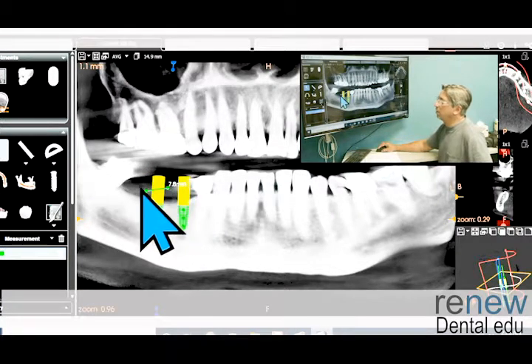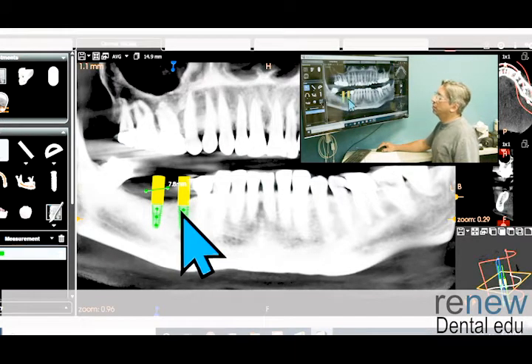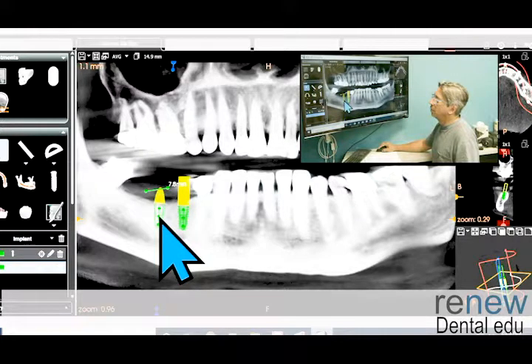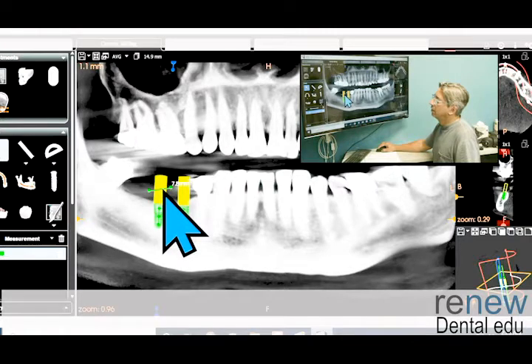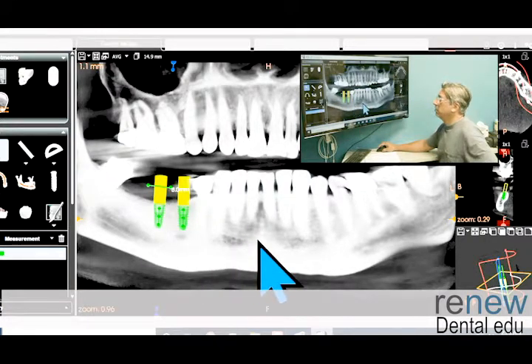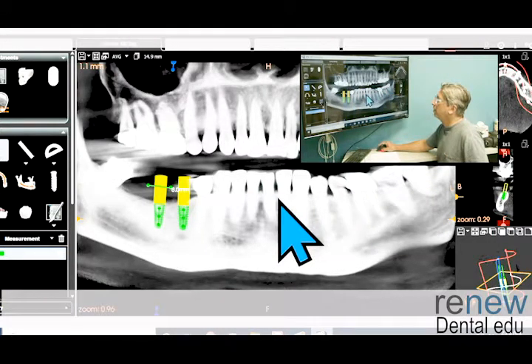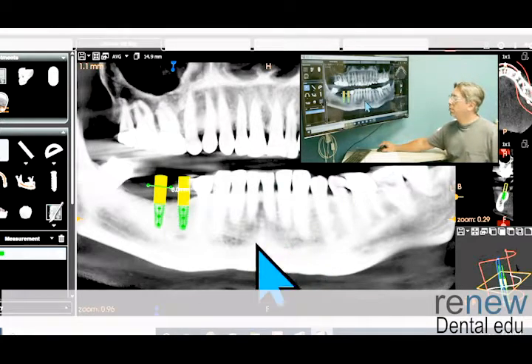So you wouldn't come to this wisdom tooth here at all, but you would get your occlusion back pretty nicely. I wouldn't worry about it. I probably wouldn't put it that far, but something like that. That's kind of what I would be thinking in placing that, and you would get your occlusion back at least to here for sure. So that's pretty good. I think that'll hold. You've got a strong bite going through here. She's got a little wear and tear here. But overall, it's a pretty straightforward case.